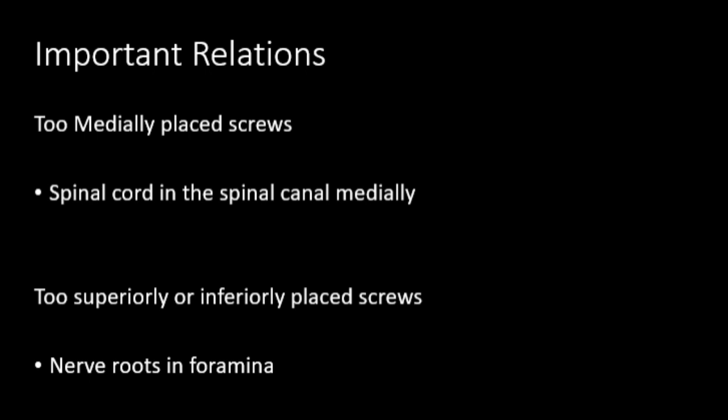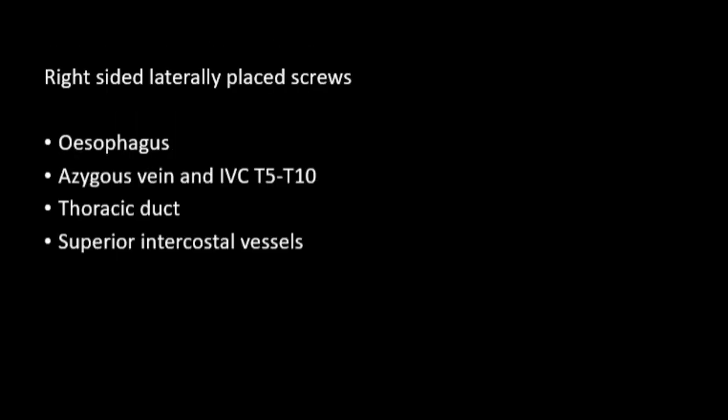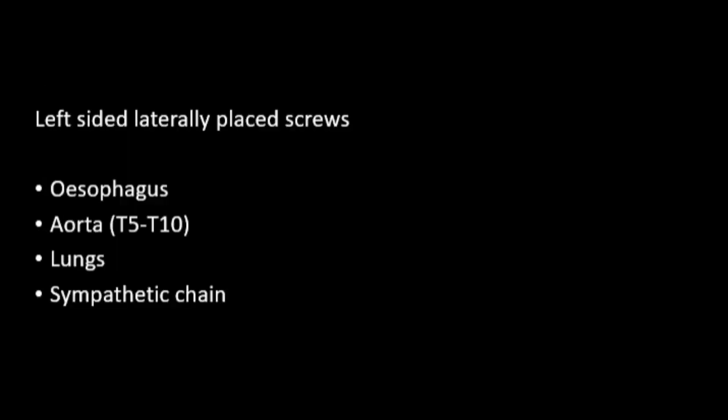Too superiorly or inferiorly placed pedicle screws can enter the neuroforamina and injure the nerve roots. Right-sided laterally placed screws can injure the azygous vein, inferior vena cava, esophagus, thoracic duct, superior intercostal vessels. Left-sided screws can injure the esophagus, aorta, lungs, sympathetic chain, all that.